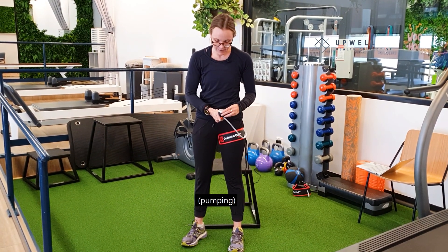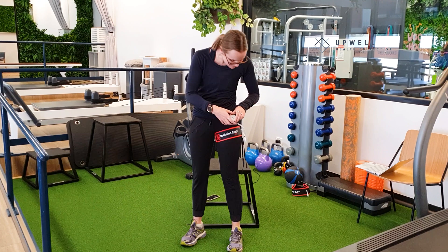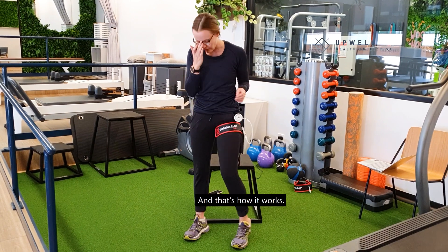So you pump it up, and then you can just tuck the handle into your pocket while you're training — and that's how it works.